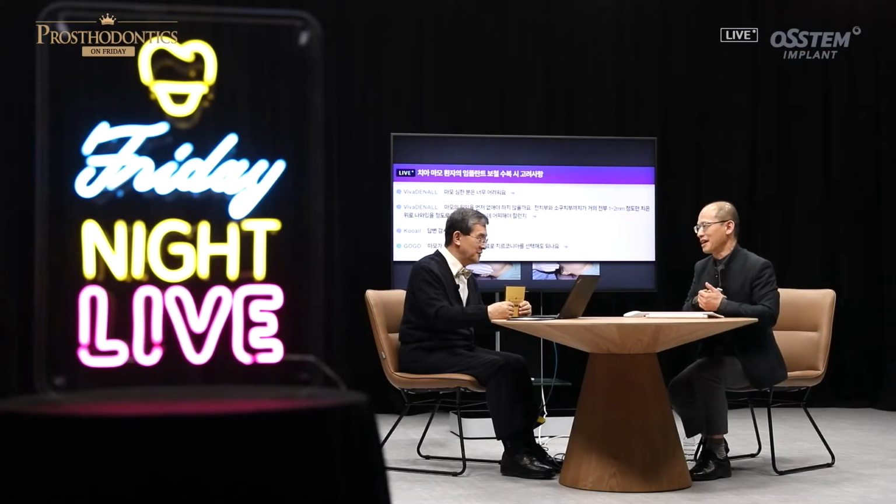So for full mouth, in terms of long-term results, whether we can opt for zirconia, I cannot say with full confidence. Another thing is fracture. Zirconia can also fracture, so we have to be really careful. For other questions, maybe I'll ask a bit later. Please continue your lecture.